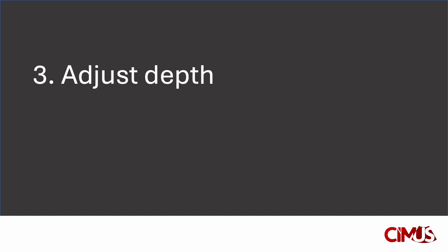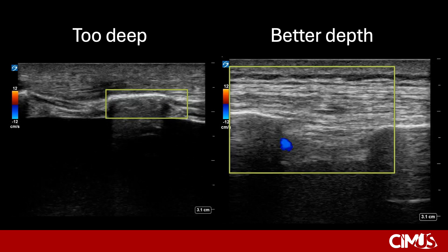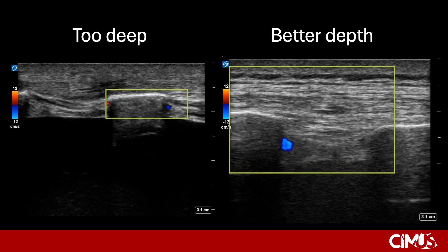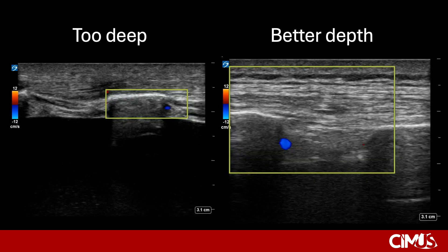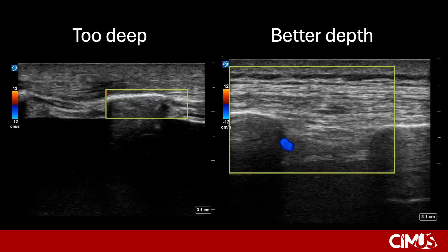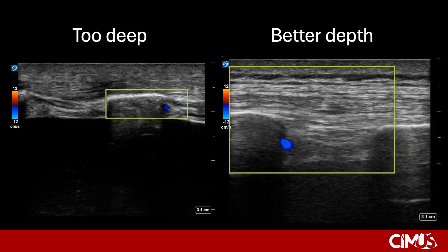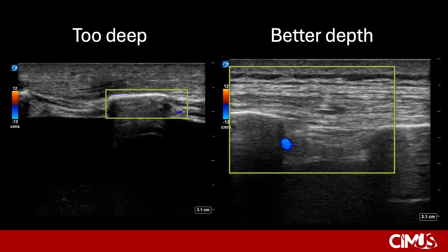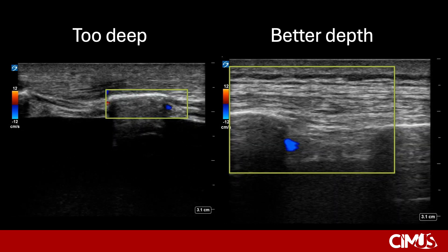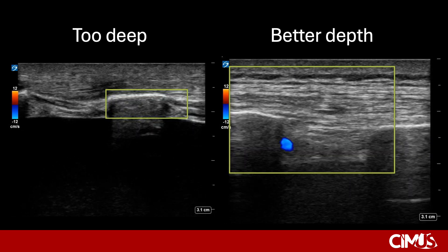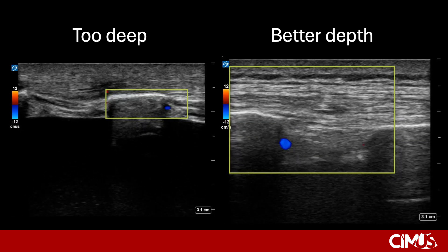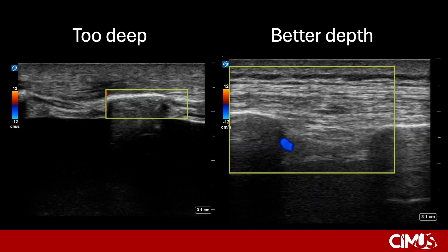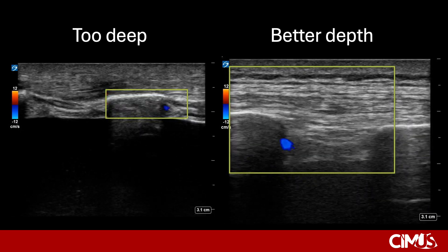Next, adjust depth. It is important to adjust the depth to ensure that the skin and tissues above the peritoneum or the pleural line are easily visualized. The video on the left has too much depth, making the skin, soft tissues, and vessel beneath the rib quite small. By decreasing depth, as shown in the image on the right, this allows for much better visualization of relevant structures.